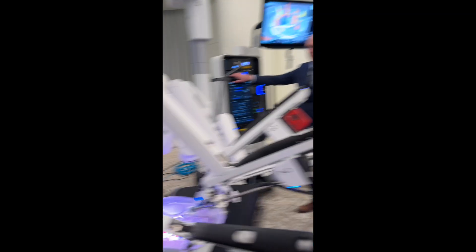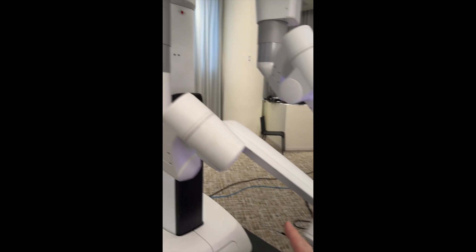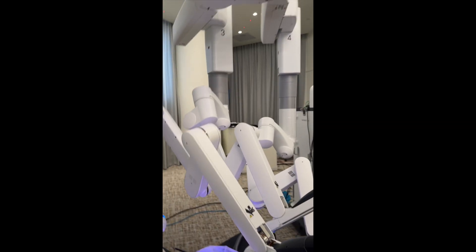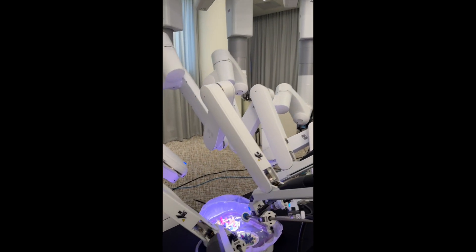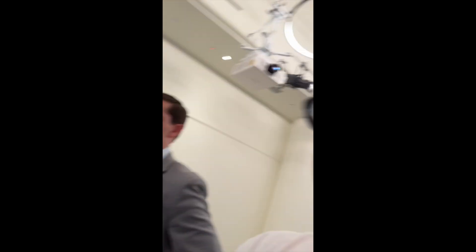I just want to show you a couple more details. This is the robot, and the arms are pretty much unchanged, so anybody who's ever used a da Vinci robot will recognize that everything looks the same. Although under the hood, everything is changing — the computing power of this thing is actually 10,000 times greater than the prior version. Can you imagine 10,000 times more computing power?